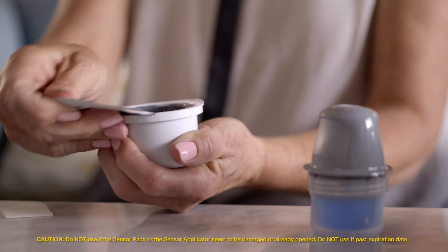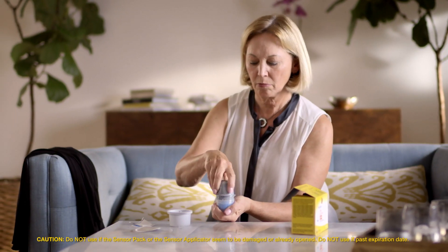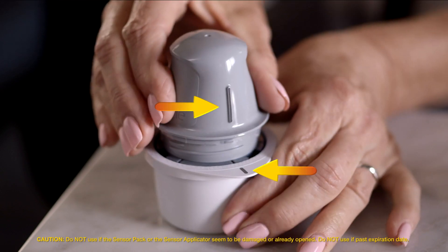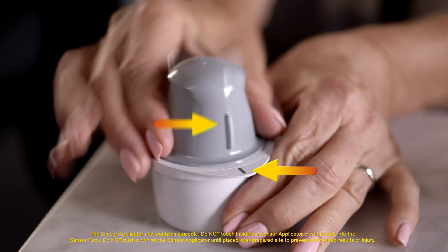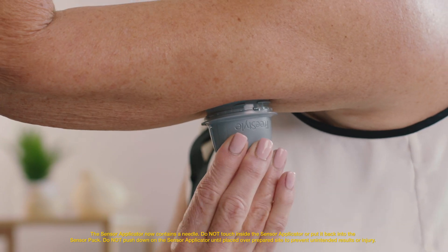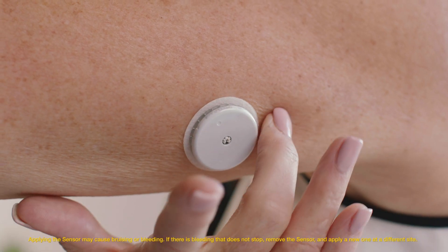Peel the lid completely off the sensor pack and unscrew the cap from the sensor applicator. Place the sensor applicator into the open sensor pack and line up the dark mark on the applicator with the mark on the pack. Then press down firmly on the sensor applicator until it comes to a stop. Simply place the sensor applicator over the site you cleaned and push down firmly until the sensor is in place.